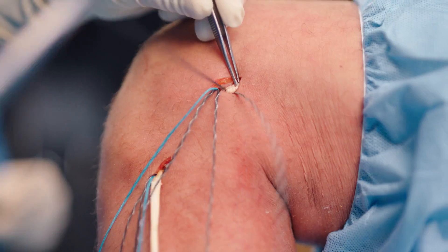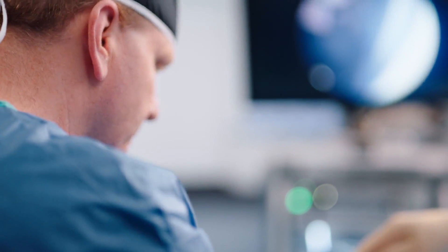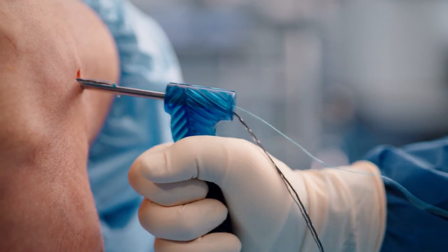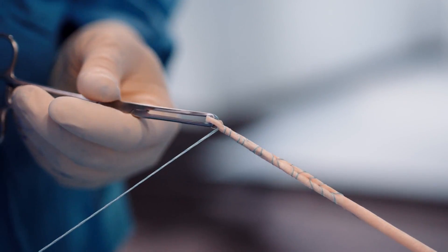These knee fiber tack anchors can be used all over the knee. We have the MCL repair, augmented reconstruction for the lateral collateral ligament, extensor mechanism repair to include quadricep tendon or patellar tendon repair. There are many different anchor configurations which allow for many different reparative and reconstructive procedures about the knee.